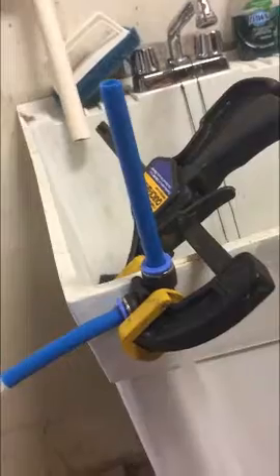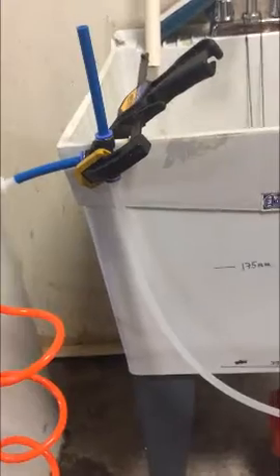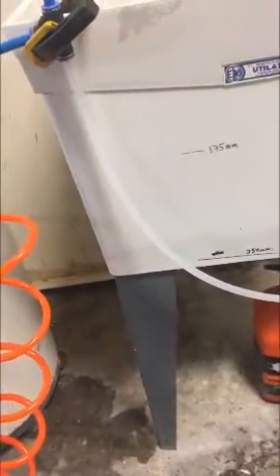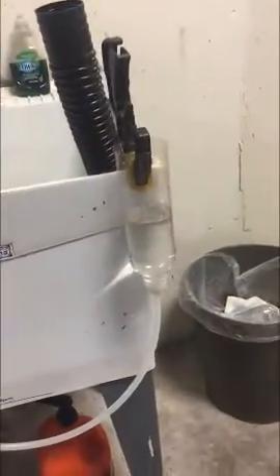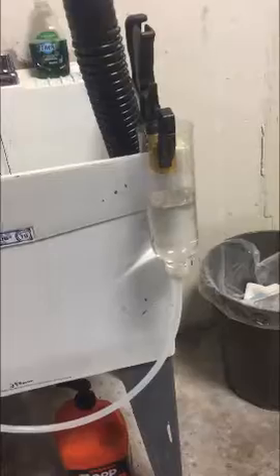That then goes into a T-junction. I'm using 3/16 tubing. There is my manometer, and on the other side I hooked it up to a drink bottle, and the reason is so that the diameter and the volume of the water in that bottle would be a lot higher. So when the water level in the tube drops by 10 centimeters, the volume in the bottle goes up by considerably less, almost nothing, relatively speaking.